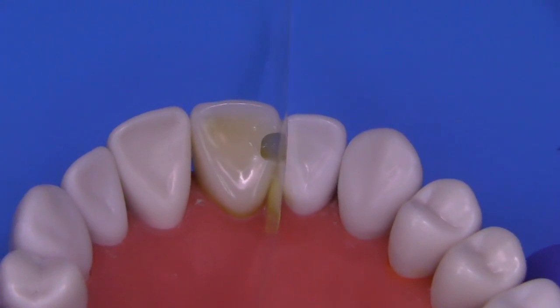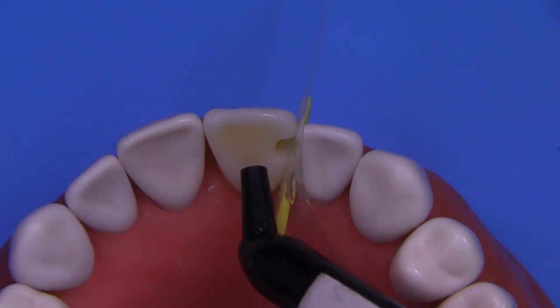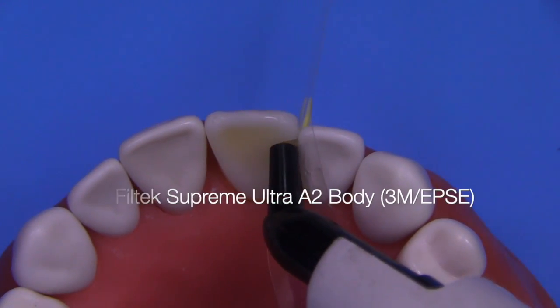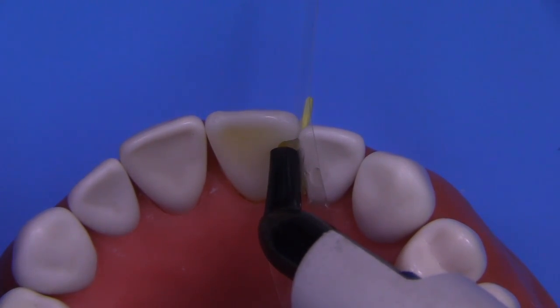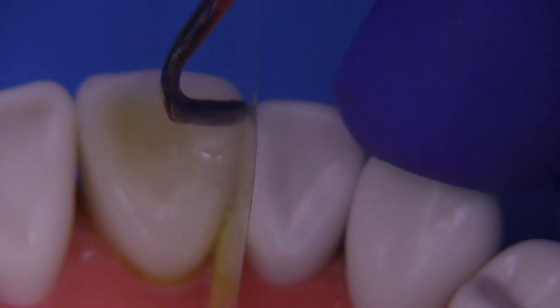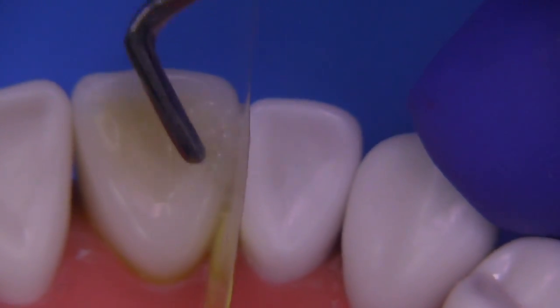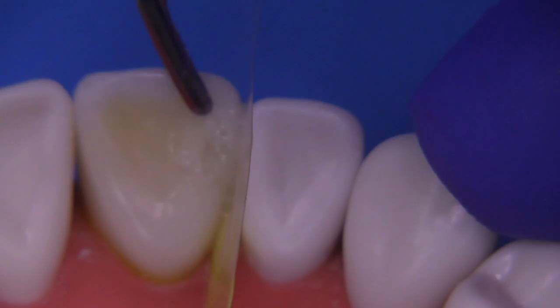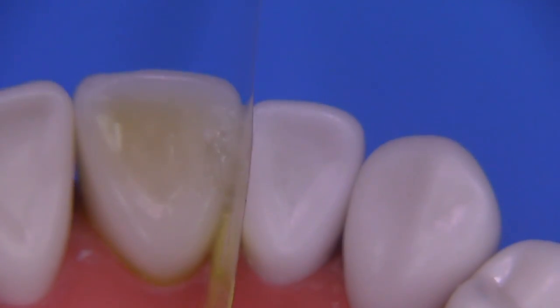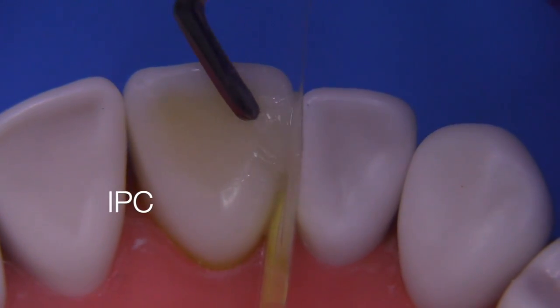You could use a universal adhesive or whatever adhesive you have available. Now, it's important not to light-cure this — we want this to be soft. So when we insert the composite, and this time I'm using Filtek Supreme Ultra A2 body, not the enamel, not the dentin, it creates sort of this snowplow effect. When you inject the composite, it squishes the adhesive out of the preparation and allows better adaptation of the composite. Then we're going to manipulate the contours before we light-cure with an IPC.